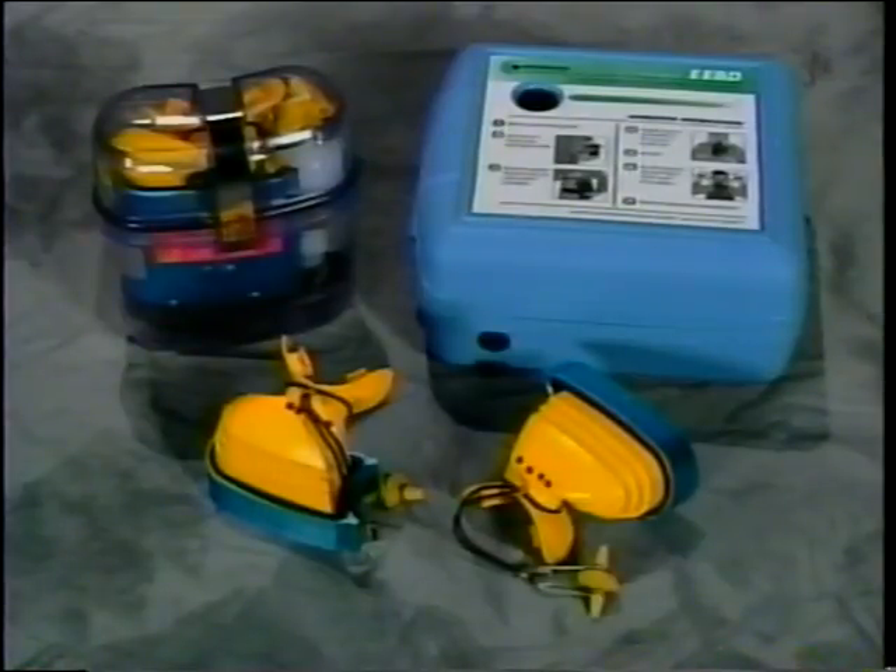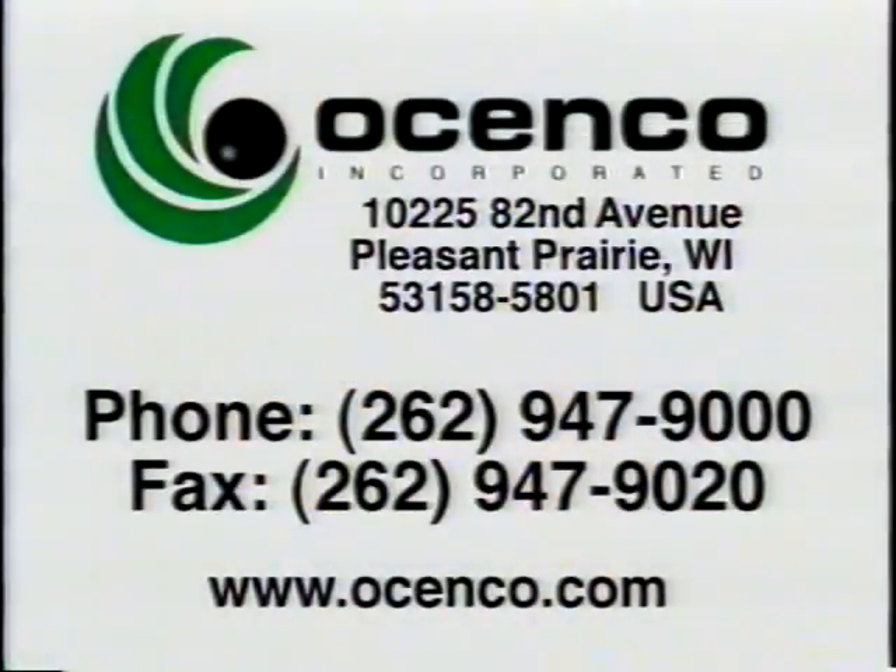The M20 training unit is not equipped with a face shield. The M20 training video, the stowage rack, and the replacement parts for the M20 training unit should be ordered directly from Ocenco Incorporated.